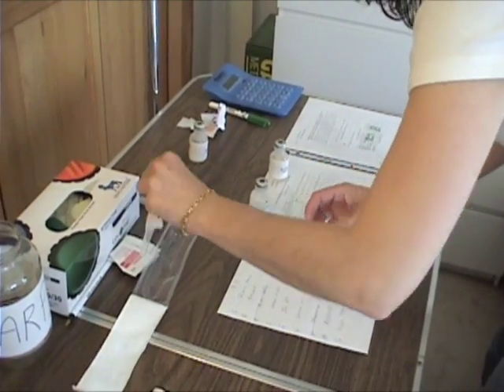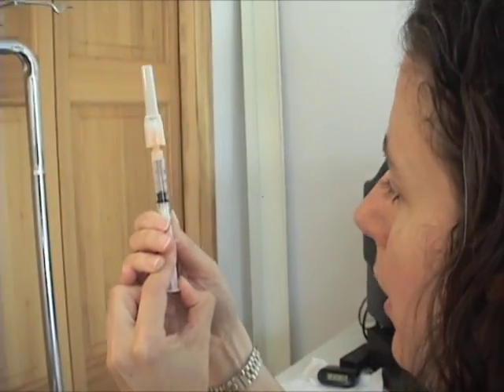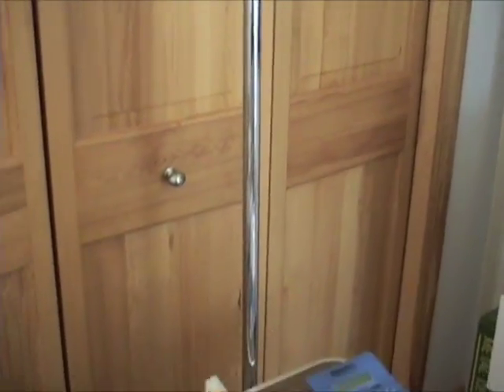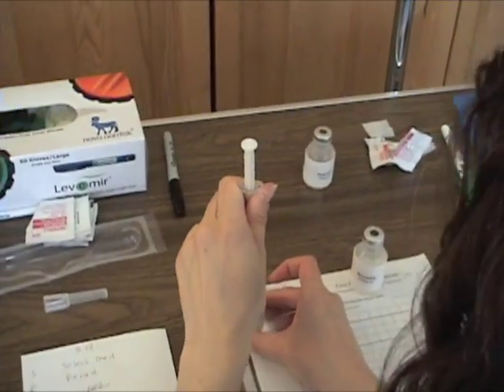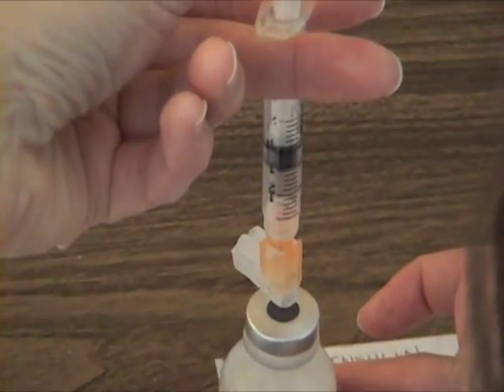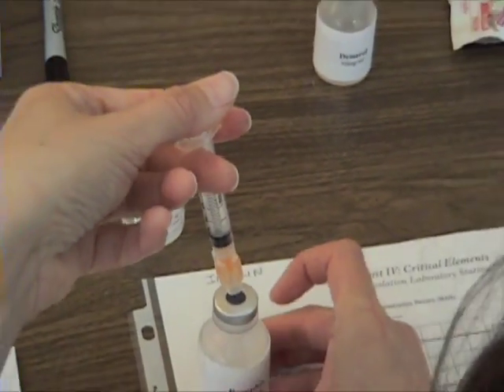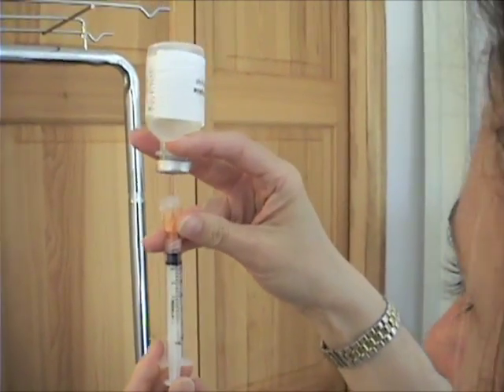Okay, and first thing, put 2 milliliters of air into my syringe, then infuse it into the first vial, all the way to 1. Okay, and then go to your second vial, infuse the rest, and now we're gonna draw the medication.